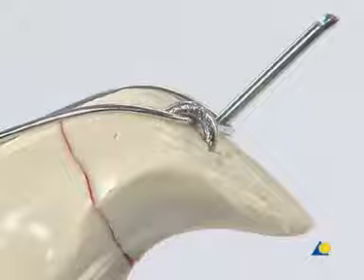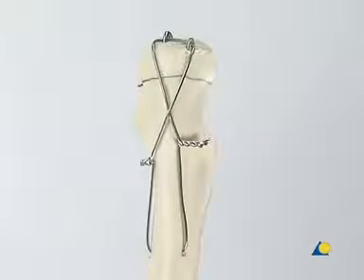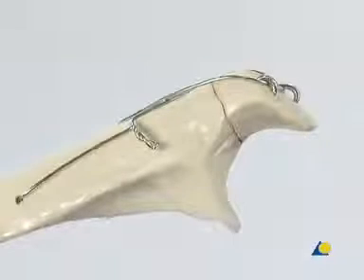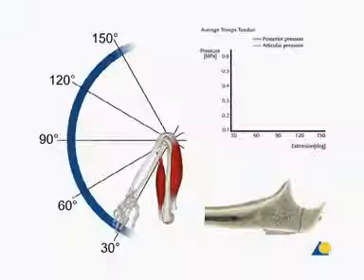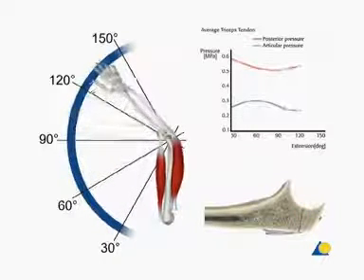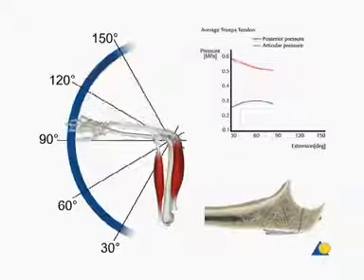This procedure is repeated for the second K-wire. A transverse olecranon fracture has been treated using a figure-of-8 tension band wire. Tension forces from the pull of the triceps are transformed into compression forces at the fracture site when the triceps is actively used.